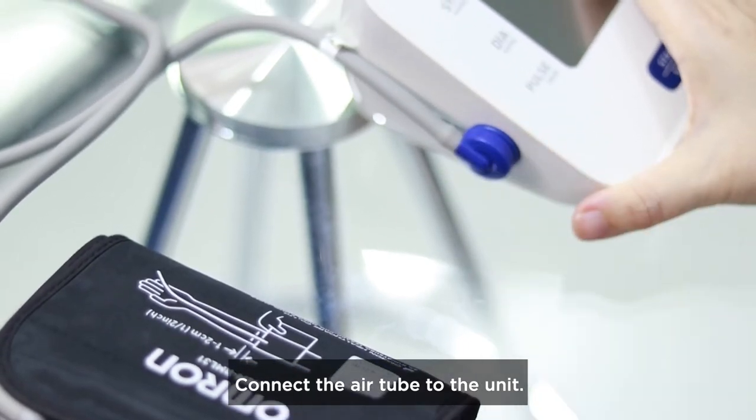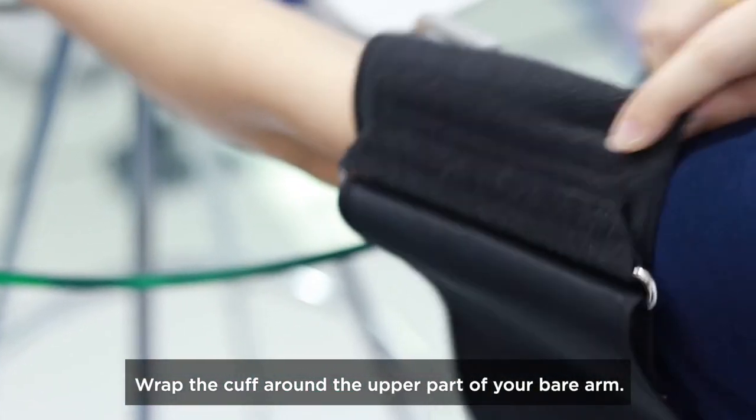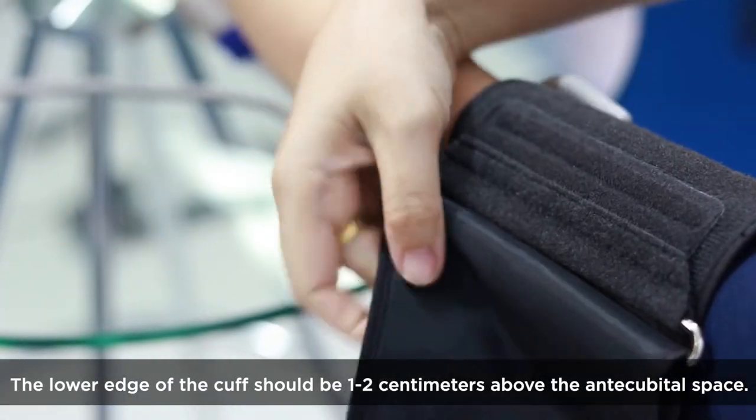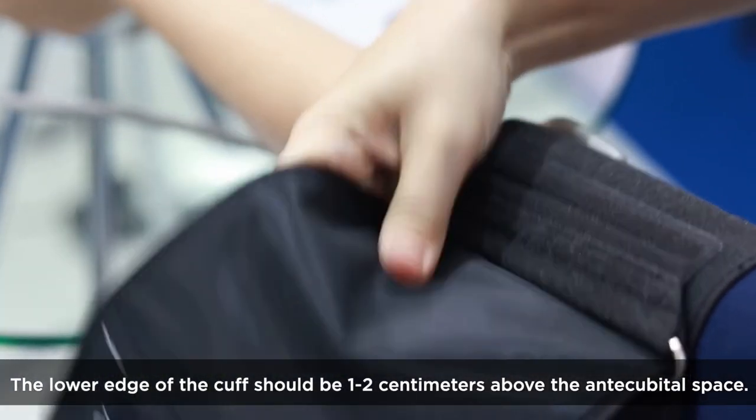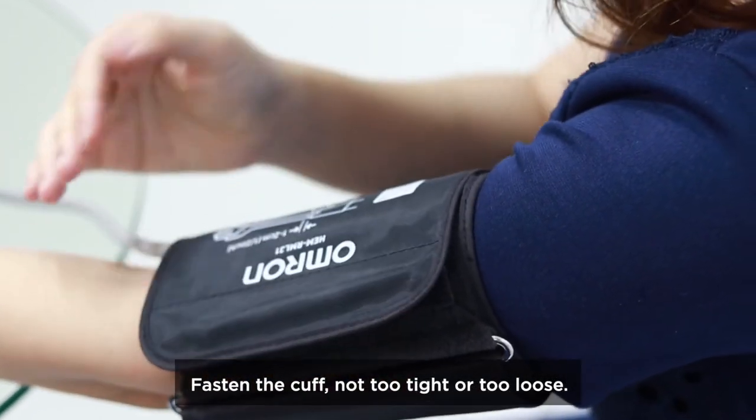Connect the air tube to the unit. Wrap the cuff around the upper part of your bare arm. The lower edge of the cuff should be one to two centimeters above the antecubital space. Fasten the cuff — not too tight and not too loose.